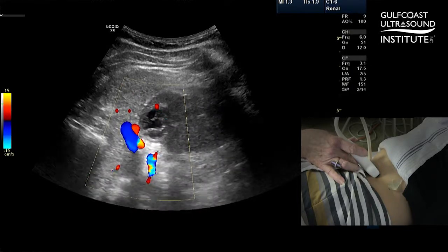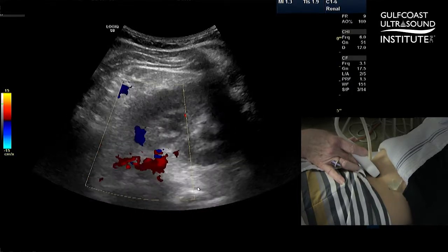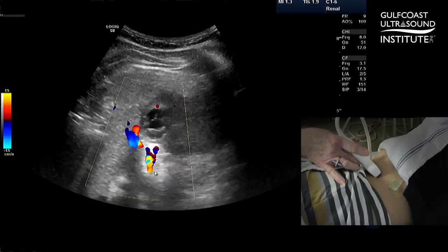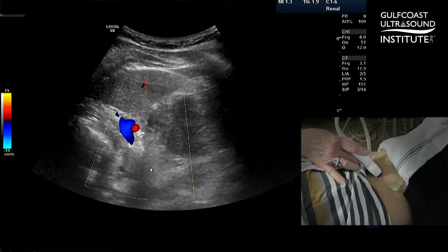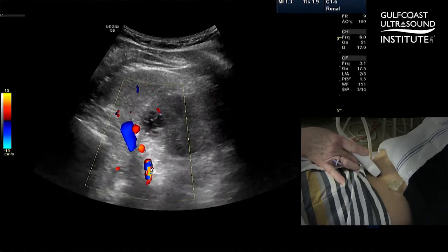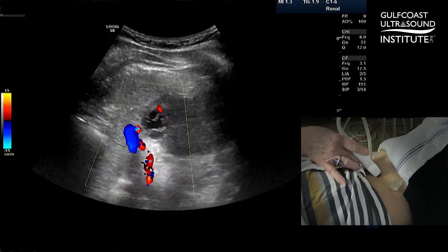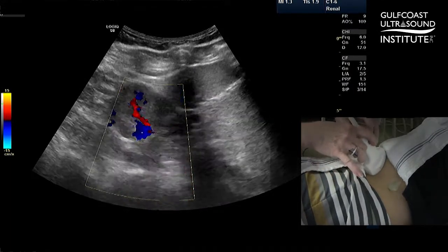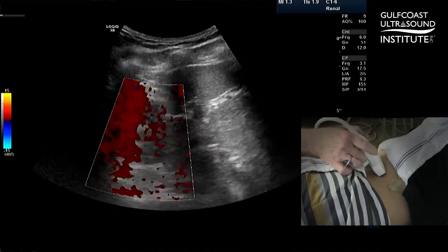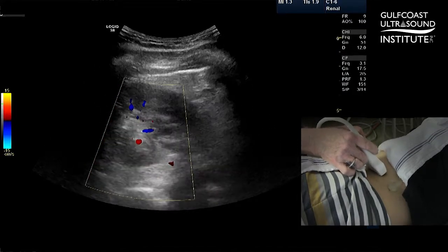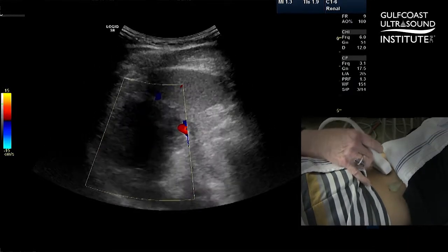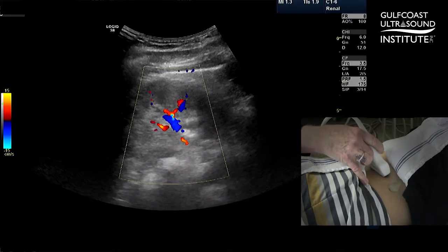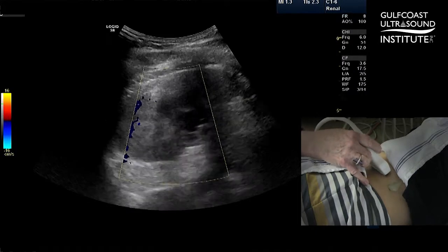Take in just a little breath. We can see the path of that renal artery, and the cursor is right now on the point where we have that subtle curve. If that position doesn't work because of rib shadows, I'm going to rotate the probe 90 degrees the other way. Now the hilum of the kidney is opening out with the position being at about 5 o'clock.